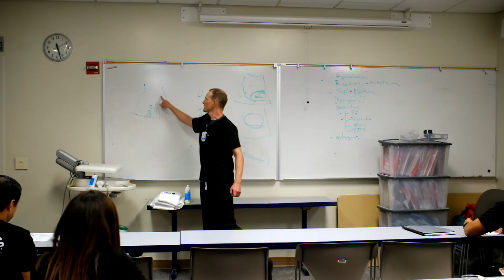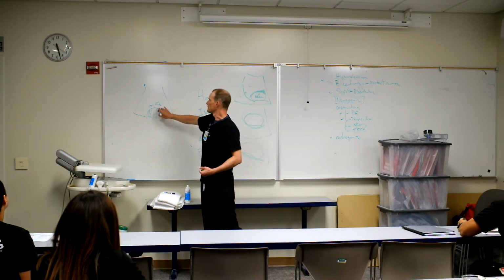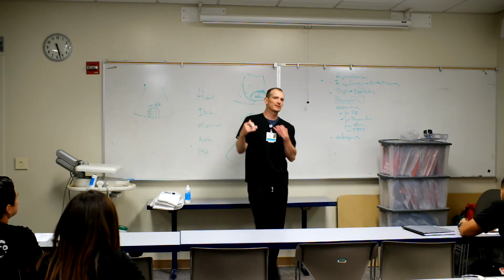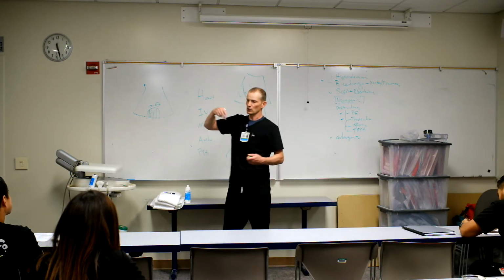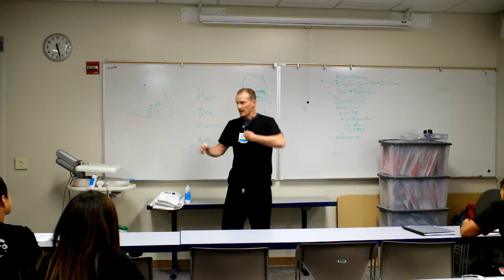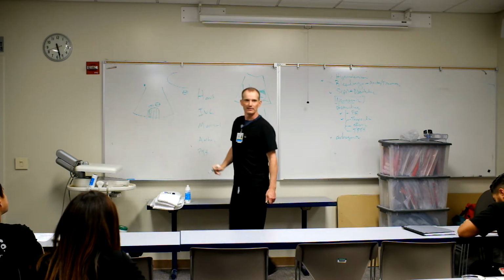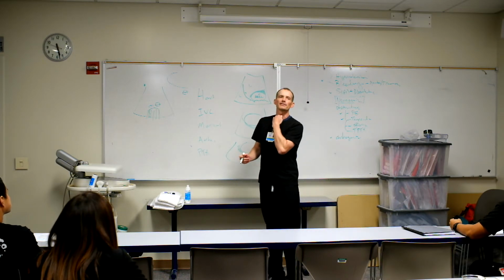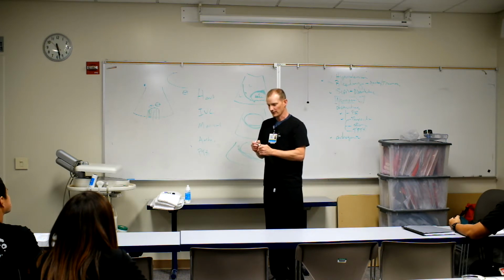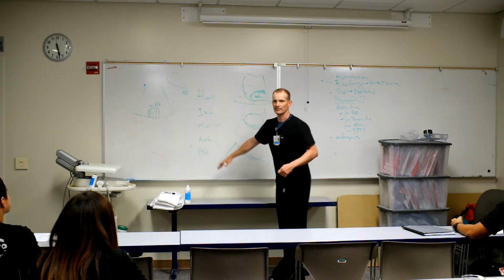Again, if you have a big aortic aneurysm that's ruptured and leaking backwards, you're not going to miss it. It's going to be really easy to see because the aorta is already up against the abdominal wall. But if it's just a dissection coming down from up in the chest, then you might have a smaller aorta that's normal size. And remember on our parasternal long axis, we can actually see the aorta sitting behind the heart too. So if you're thinking about it, you might see a flap there, right? Okay. I wouldn't bother doing the suprasternal. If you're really good, do it. But if you're not, don't waste your time because you could move on to this exam and it'd be higher yield. Okay.